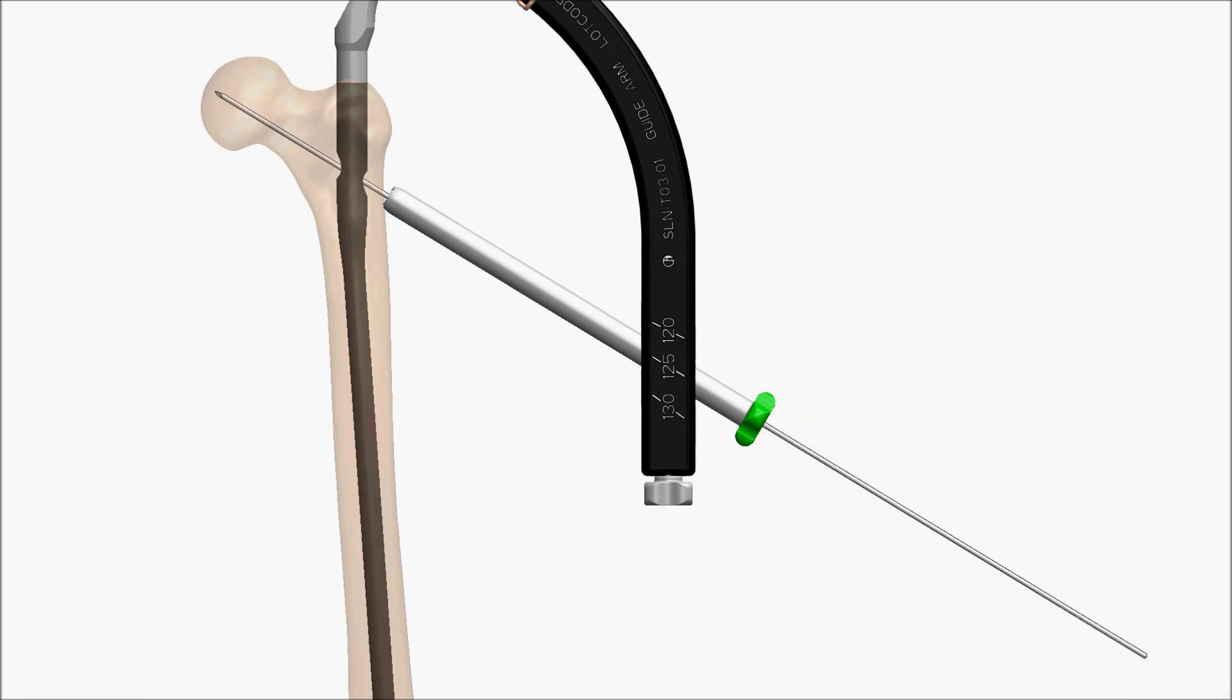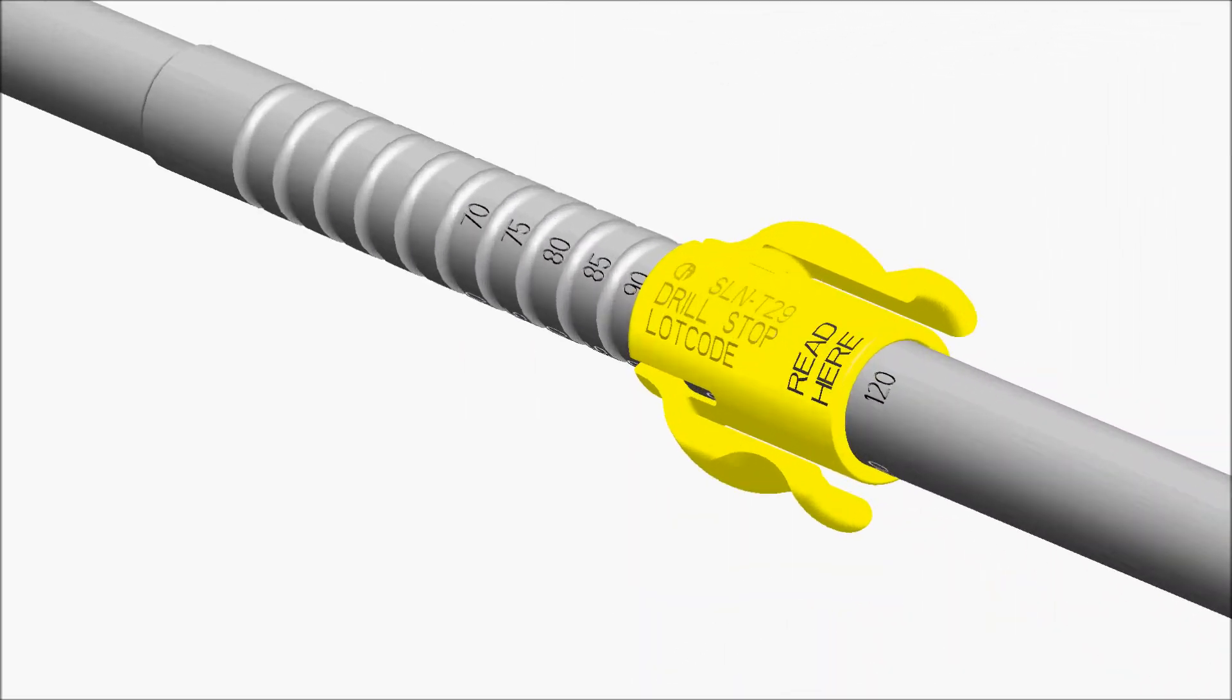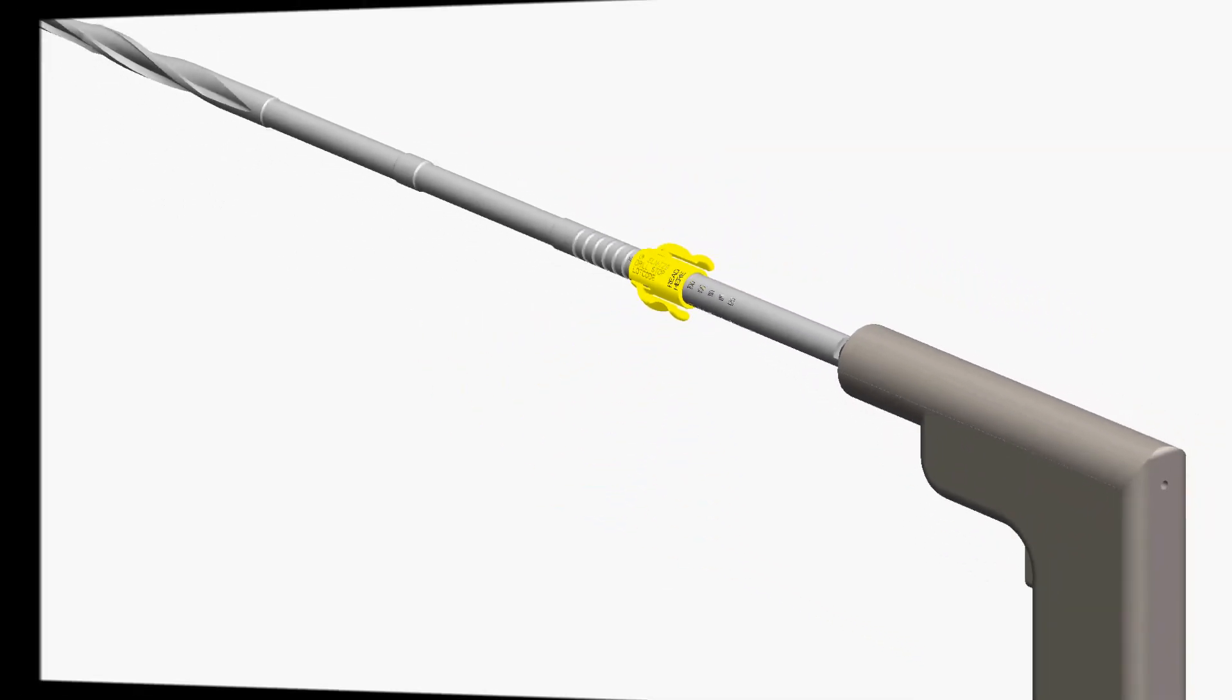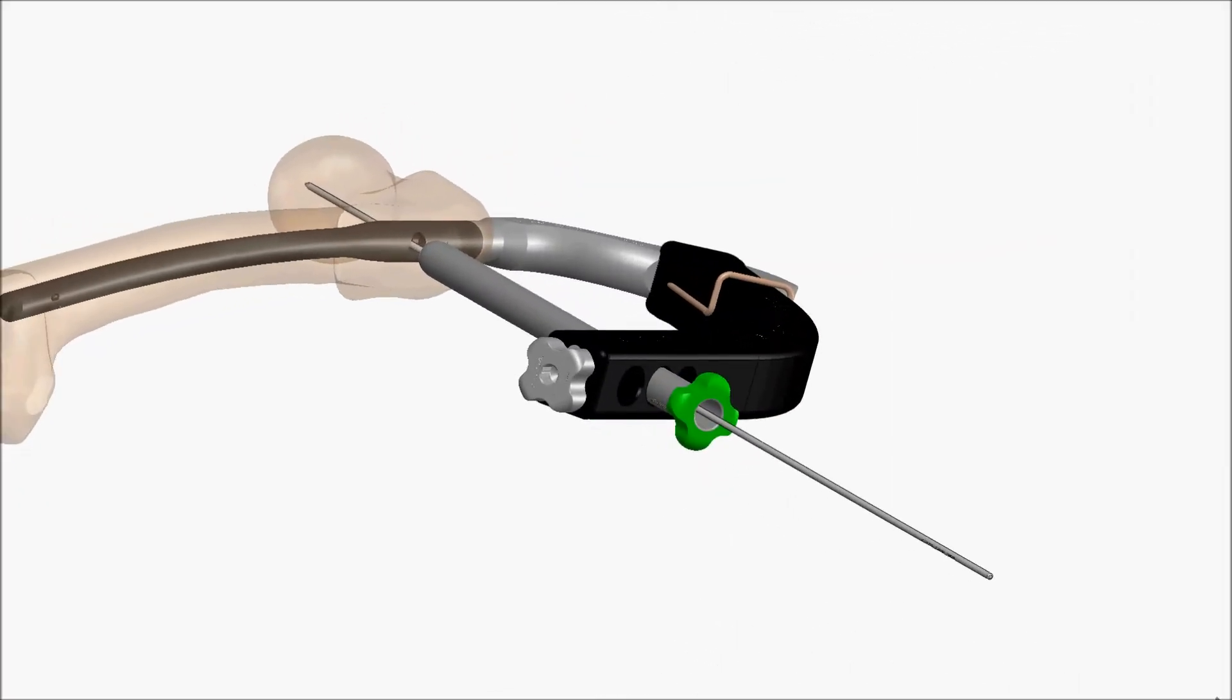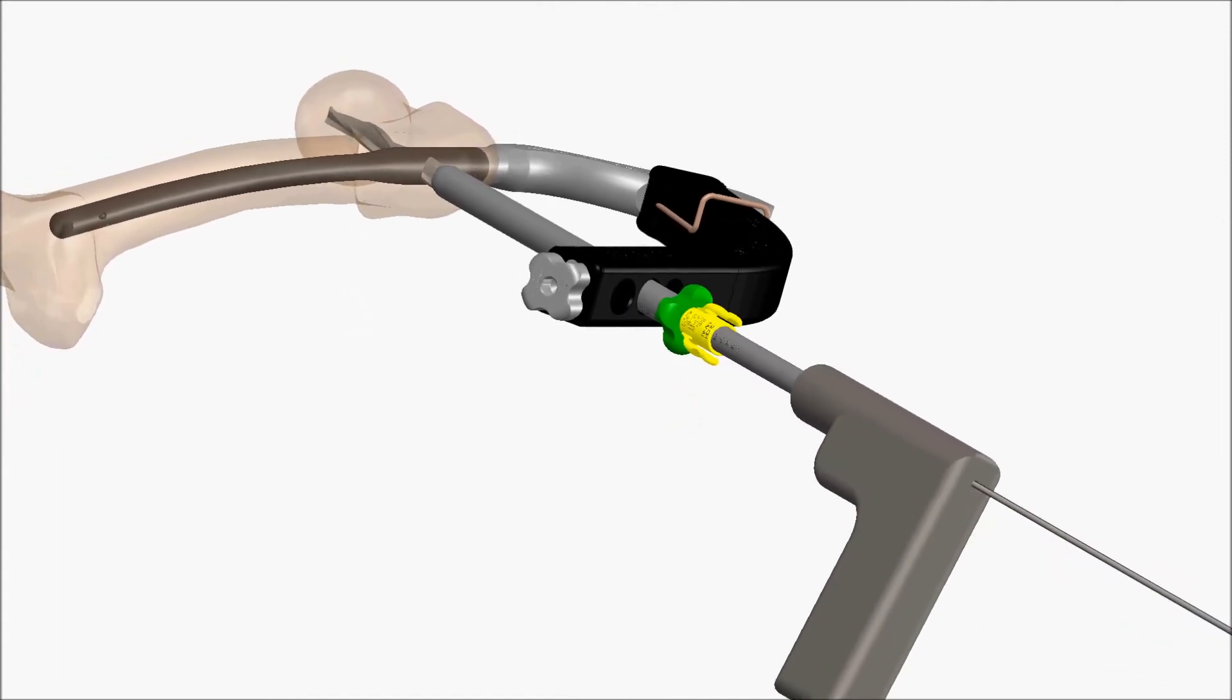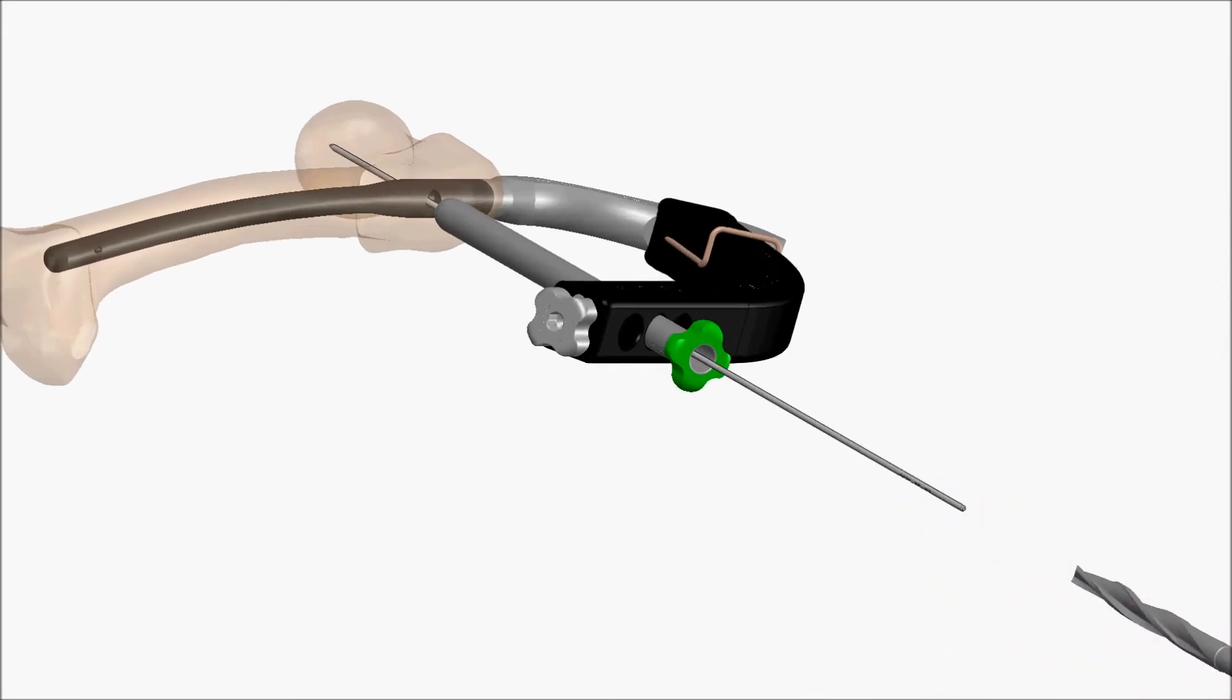Remove the guide sleeve obturator. Set the drill stop to the desired drilling depth. Drill the proximal femur. Use the pin pusher to ensure the guide pin remains in place during drill removal.